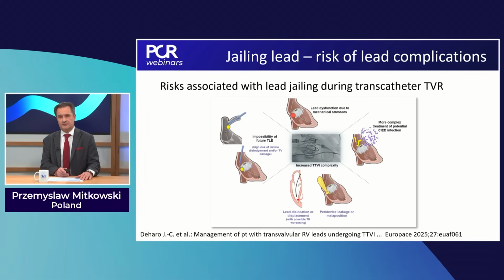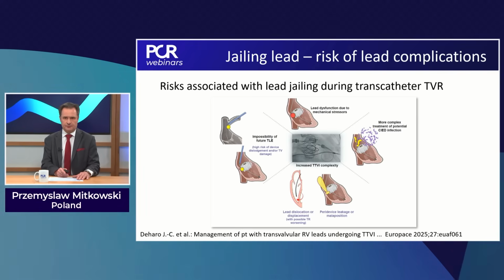Of course, we have numerous conditions, and many of them were already mentioned today. But what I'm afraid of, especially in older leads, is that we have somehow damaged insulation. When we put any pressure over the insulation, it could break, and we will get some noise on the lead, and the pacing properties of the lead can no longer be supported.